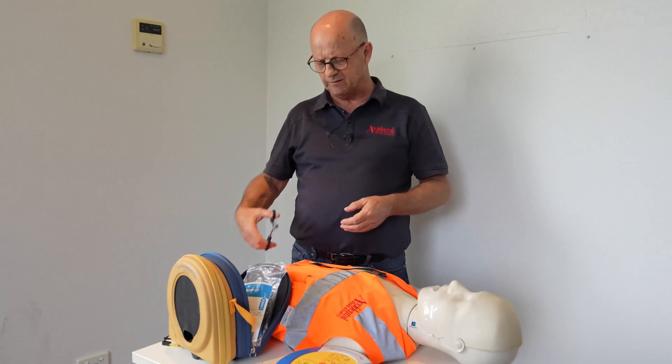Assessing heart rhythm — do not touch the patient. Our defibrillator is now assessing the heart and registering some activity. In this case there is activity, but the heart is not beating correctly, so it will provide an electric shock to reset the rhythm of the heart and make it operate properly.